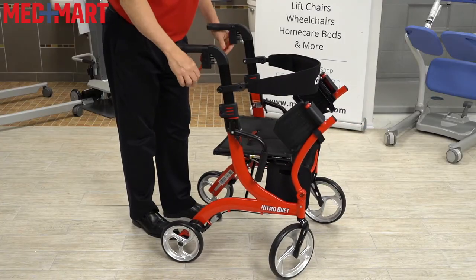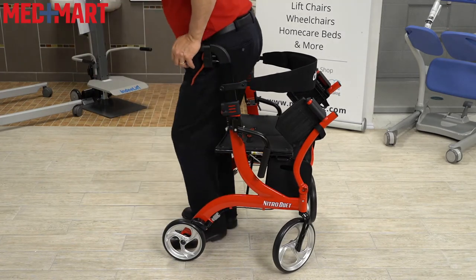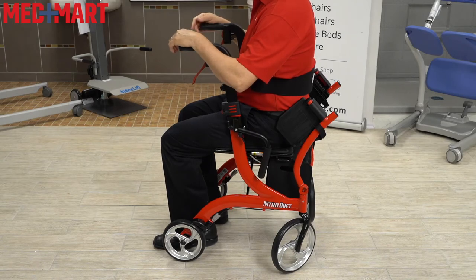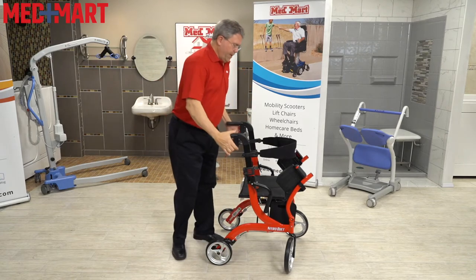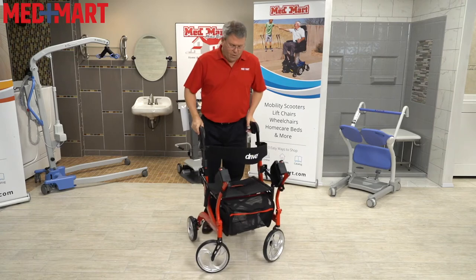Just like most standard four-wheel walkers, apply the brakes when you get tired and have a seat. You're going to have your backrest, making it very easy to sit, relax, and catch your breath. Always make sure your brakes are on when you're getting up and getting down. Then you can continue to move and use the walker as normal.